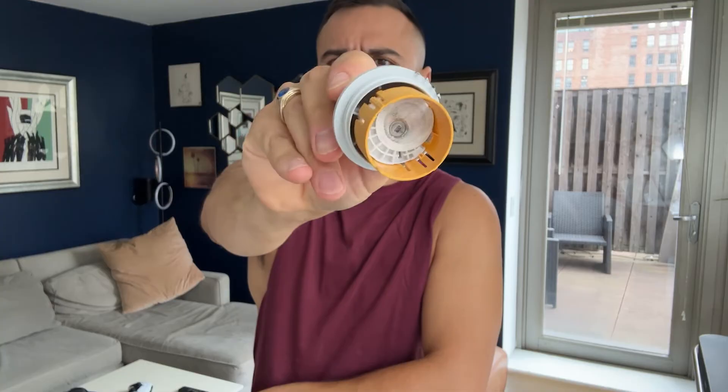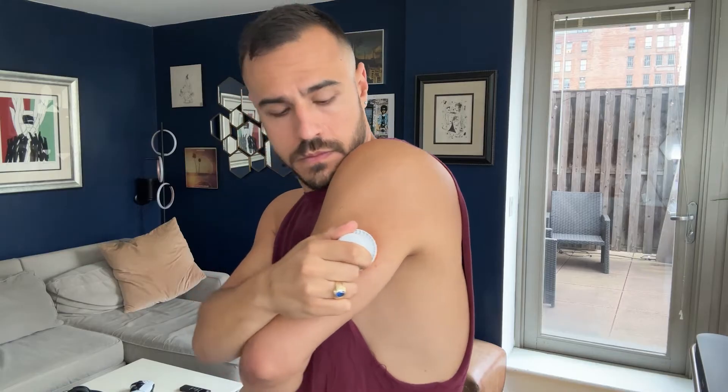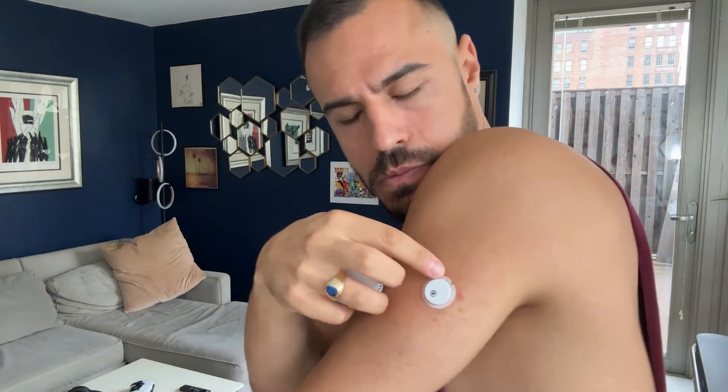In order to put the Libre 3 on, you use an applicator. The applicator is very similar to what's used with the Dexcom G7 — you just push it down and then it inserts into your skin. It also inserts at a 90 degree angle, similar to the Dexcom G7. The two times that I've put this on, zero pain — I didn't have any issues with stinging.